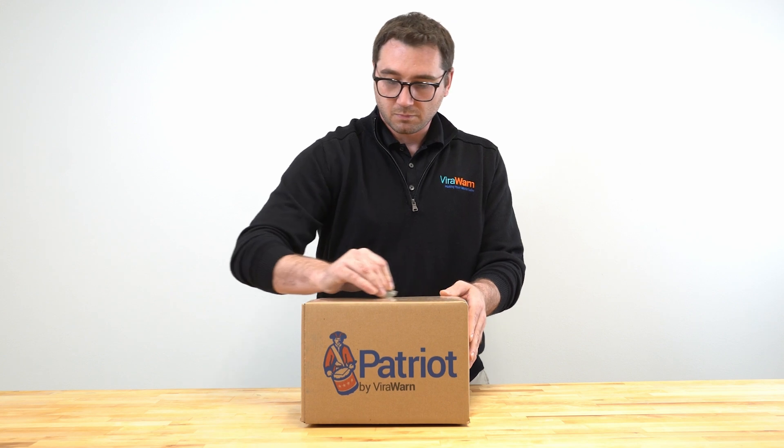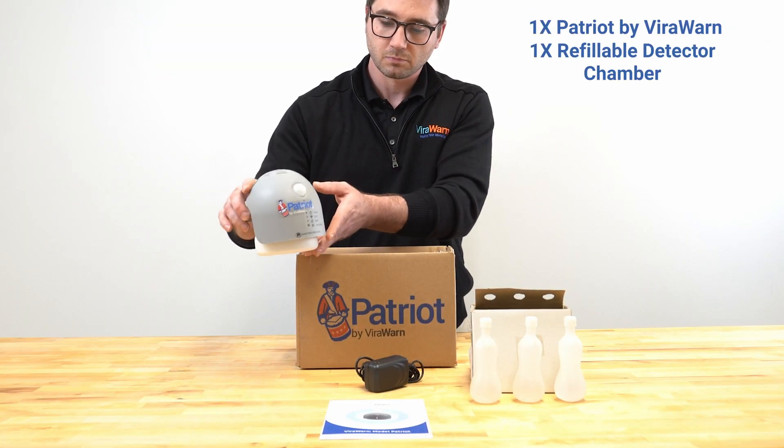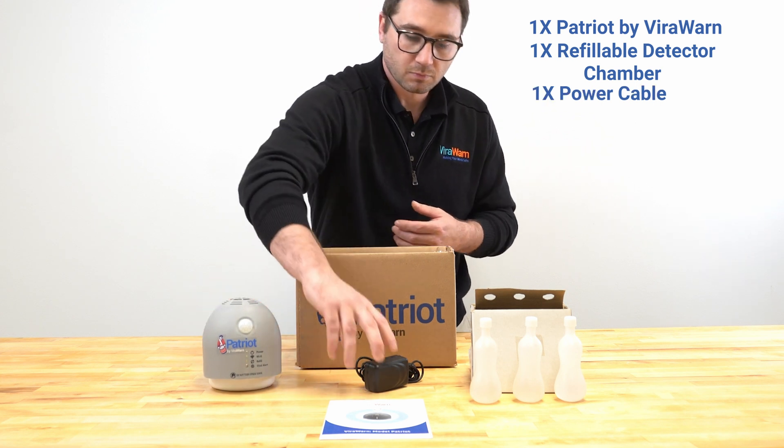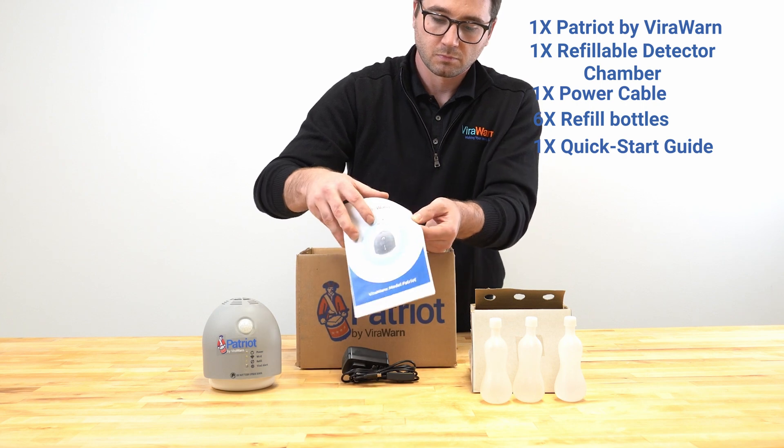Unpacking the box: Patriot by ViraWarn comes with 1 Patriot by ViraWarn device, 1 refillable detector chamber, 1 power cable, 6 refill bottles, and a Patriot by ViraWarn quick start guide.